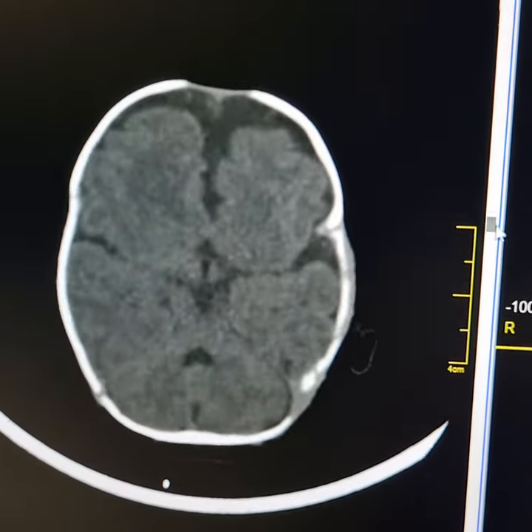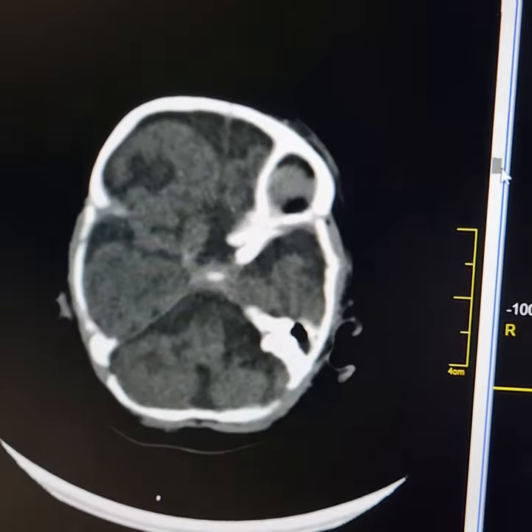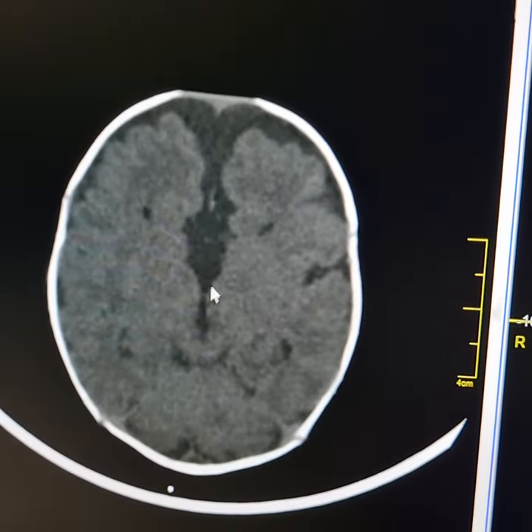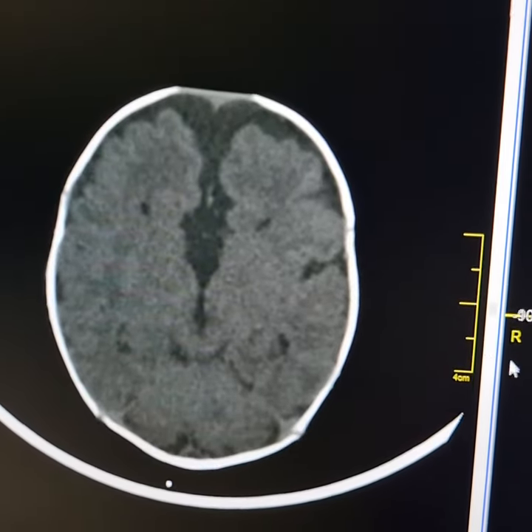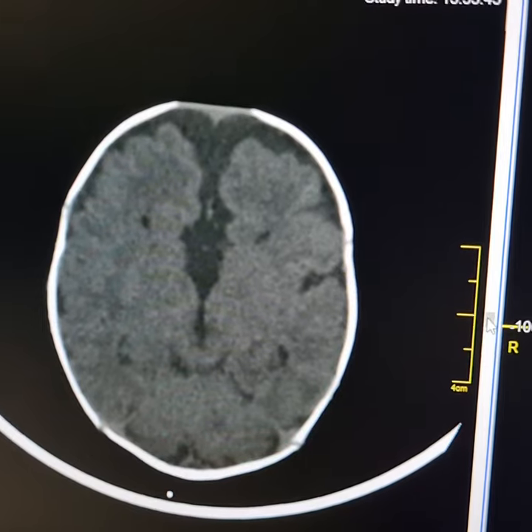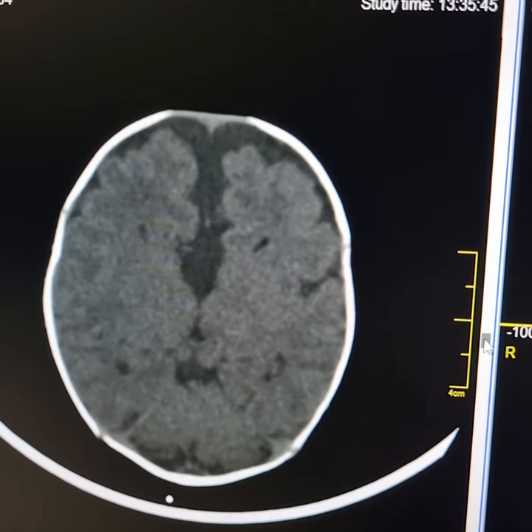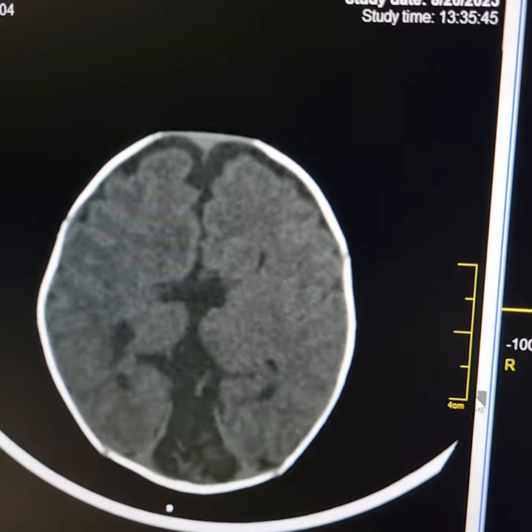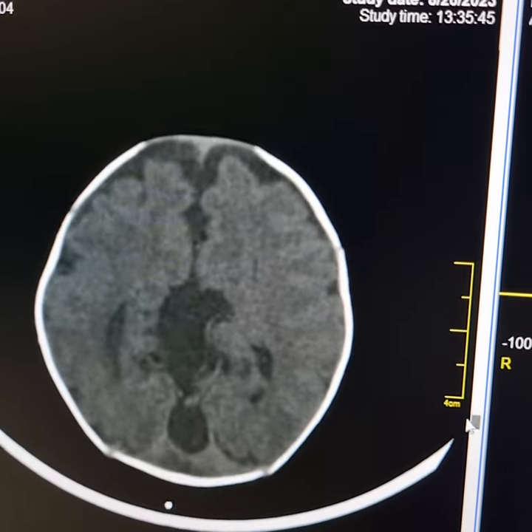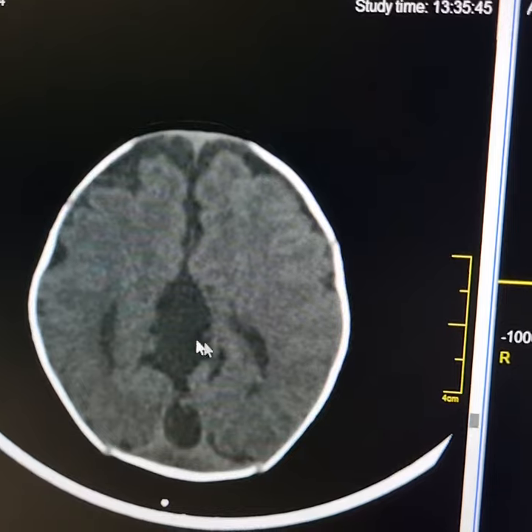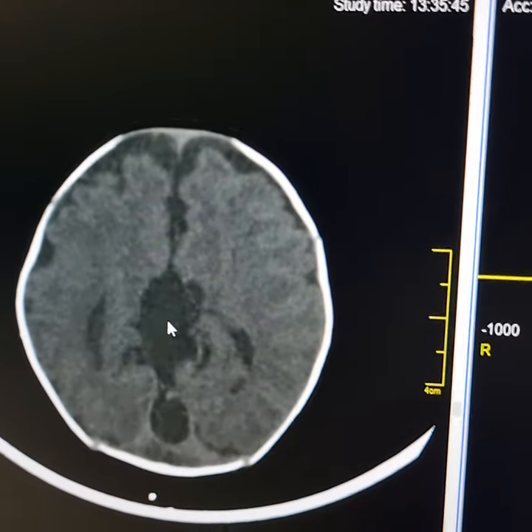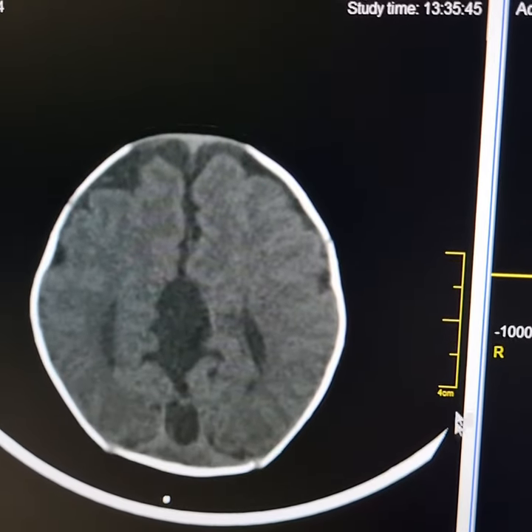Now I scroll it down and up again. There is dilatation of the third ventricle which extends upwards in between the cerebral hemispheres. Please observe this cystic dilatation here.